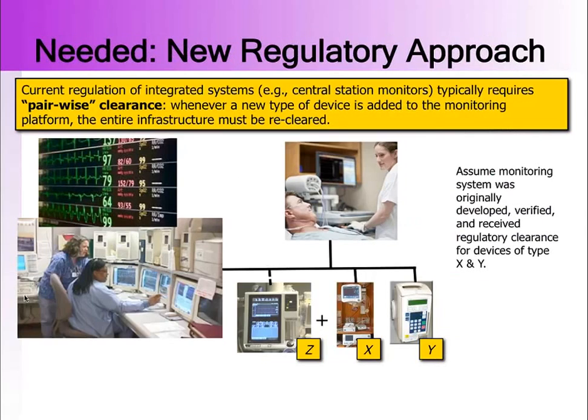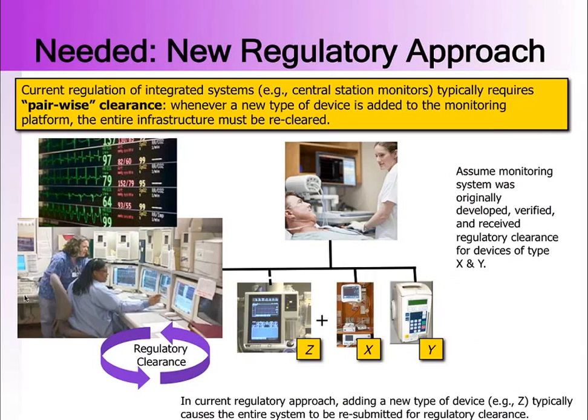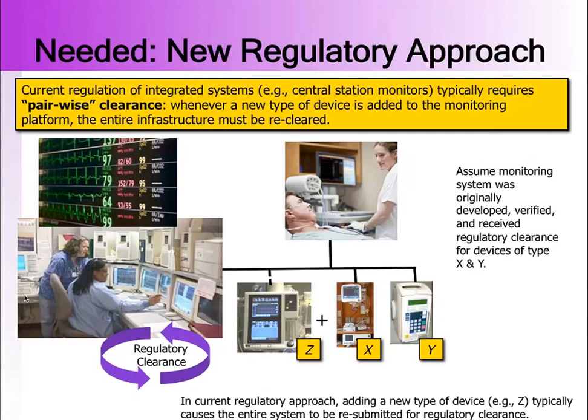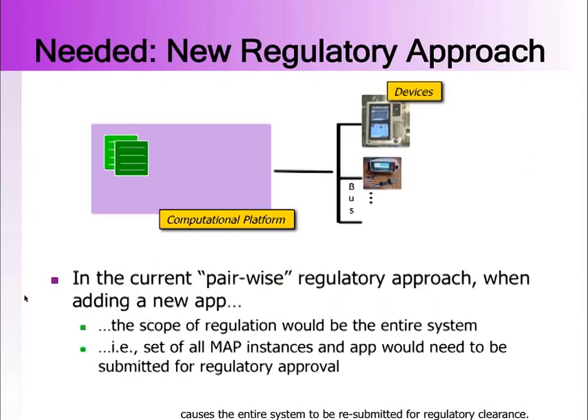You're welcome. So what's needed is a new regulatory approach and a new approach for safety standards in this space. The way that it works is you may have an integrated system, like here's a clinical monitoring station which is integrating a number of different devices in a number of different rooms. Again, if you add a new device, now you have to go through the entire regulatory clearance again. Now there are some exceptions which I'll acknowledge on the current slide, but we can see that if we want to enable this type of platform approach, if you force people to follow this in a strict way, you're not going to develop the market and the business case that would be necessary for people to develop systems like this.